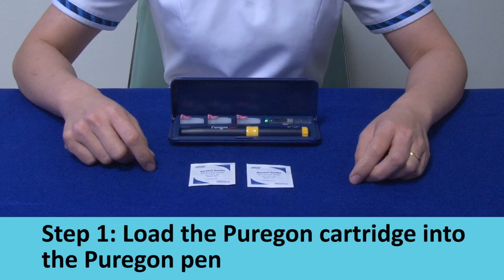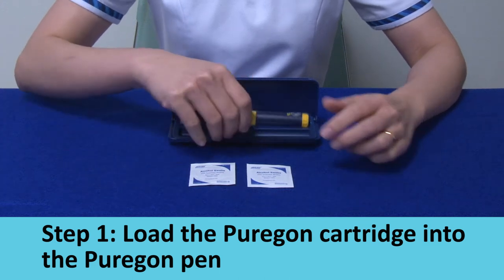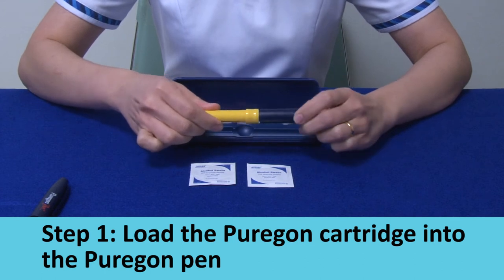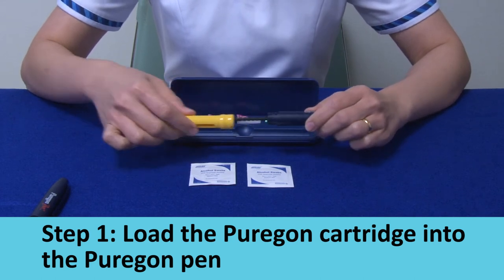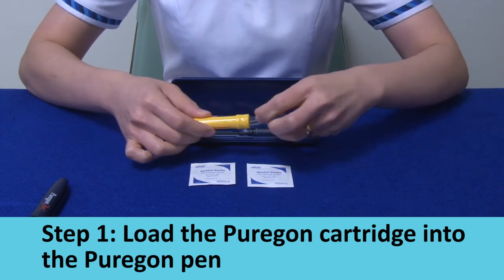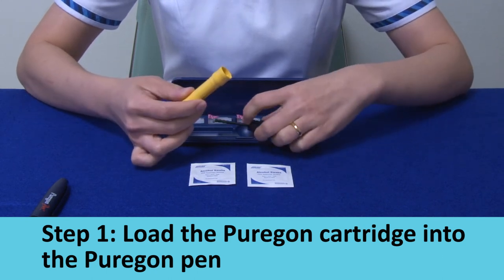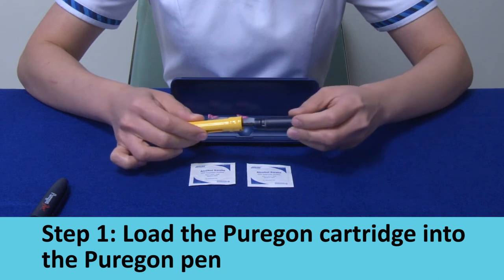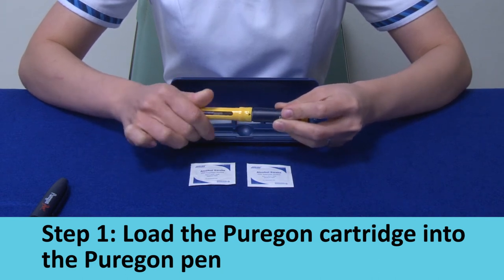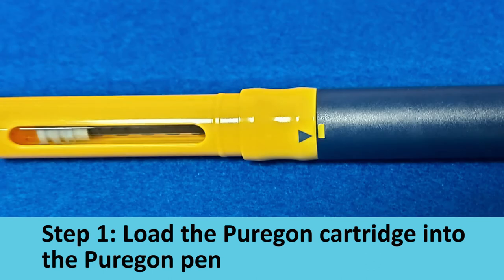Step 1: Load the Pyoregon cartridge into the Pyoregon pen. Remove the pen cap and unscrew the pen body from the cartridge holder. Insert the cartridge into the cartridge holder with the metal rim part going in first. Ensure that the arrow and alignment mark are aligned, with no gap between the pen body and the cartridge holder.